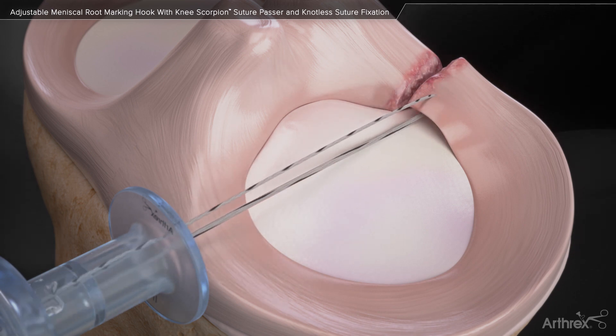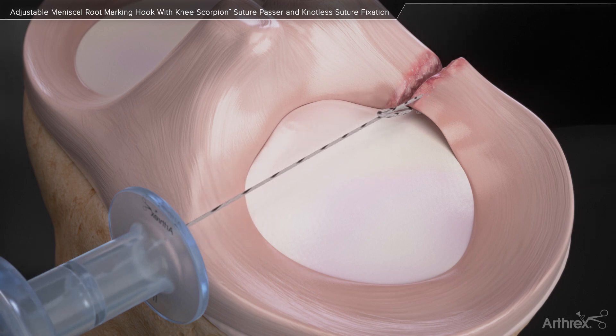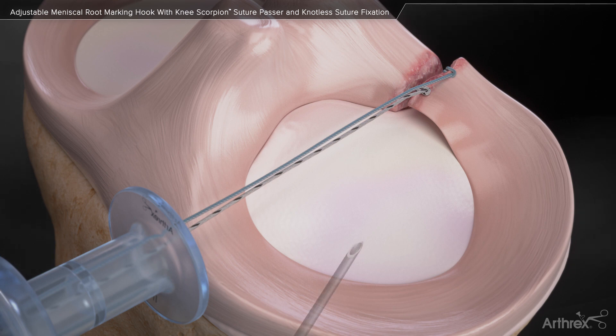Pass the suture to create a cinch stitch in the periphery and central zone of the meniscus. A second cinch stitch can be placed if desired.